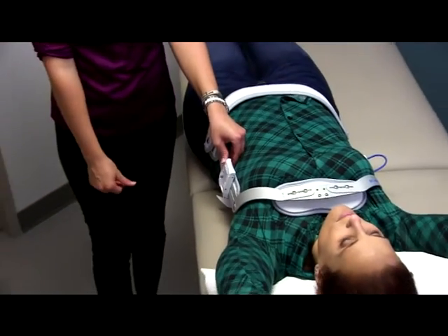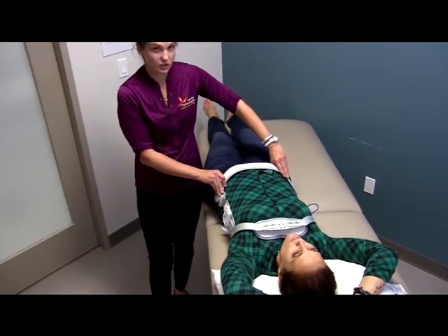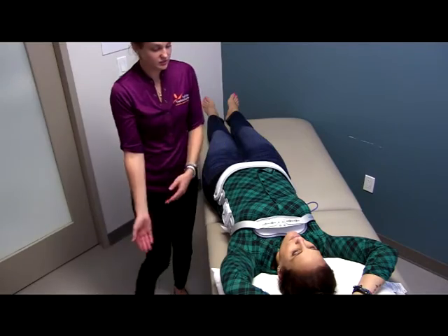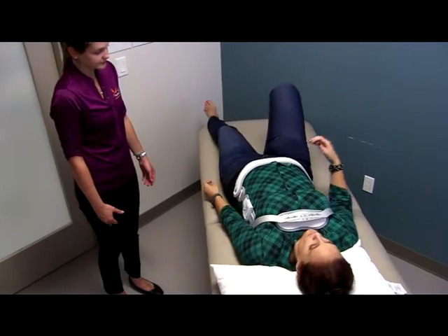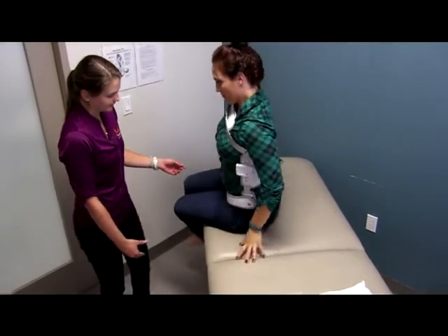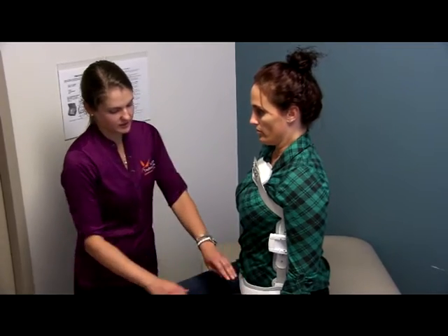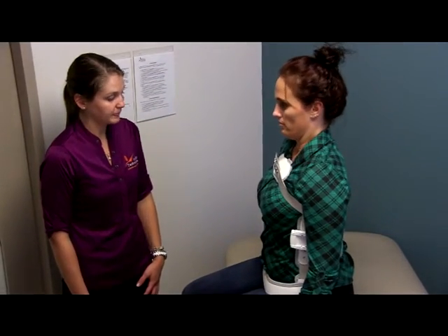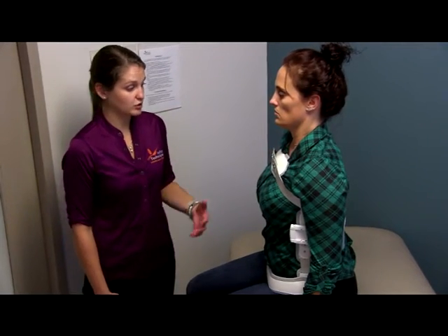One thing to note about this brace is that your orthotist should have unlocked the pelvic portion so that it's hinged — this is for sitting purposes. When the patient sits up, she can lift up this piece so it doesn't dig into the top of her thighs when she's in a seated position. Once she's sitting up, we can make sure that the chest piece is still in the right place and that the back strap is nice and snug on the patient. The tighter she's able to wear it, the more support it's going to give her.